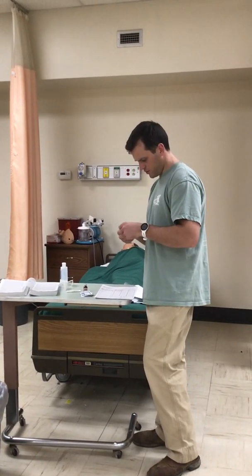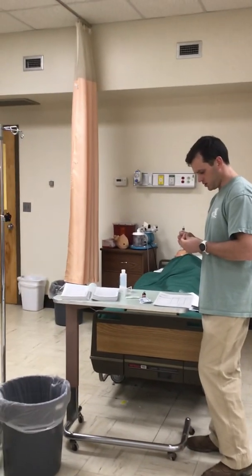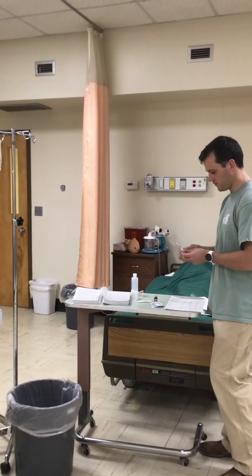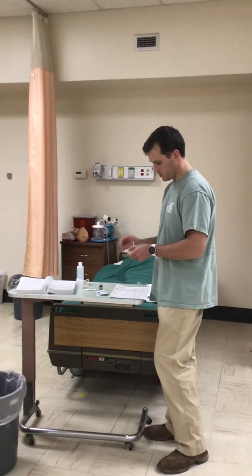I will not have to use any flushes because it is already being flushed through my primary, which is very convenient.